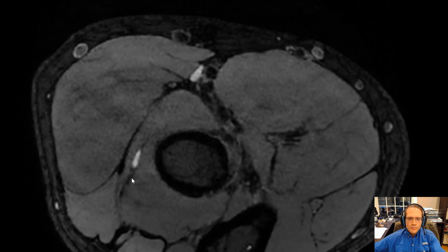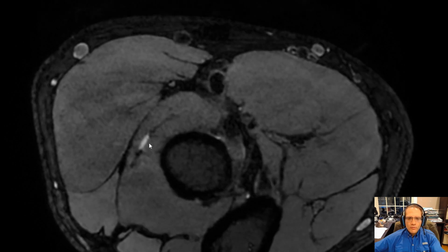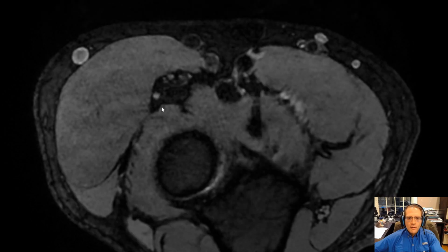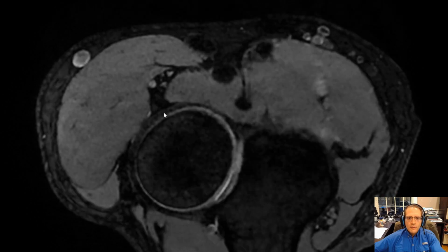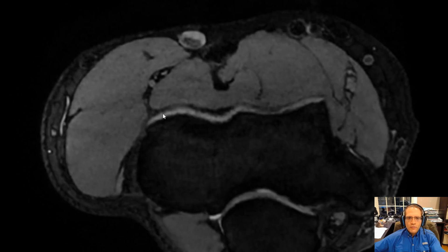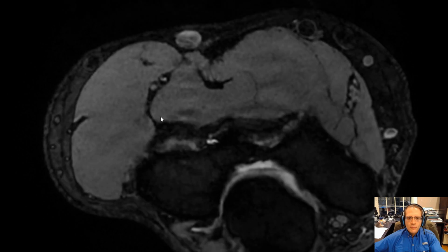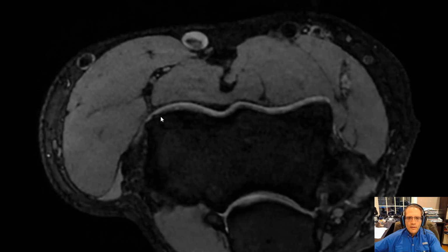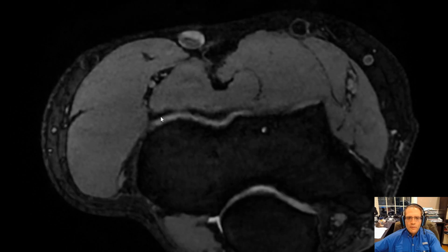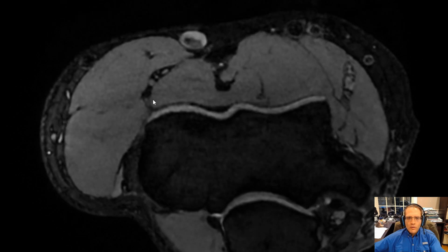So once again, now going backwards up through the nerve. So now we're following it retrograde, supinator, back up under the arcade, follow it there. There's that constriction point. I'm going to roll through that again. There's that constriction point right there. Boom. Right there. You can see that nerve kind of getting smaller and then larger.